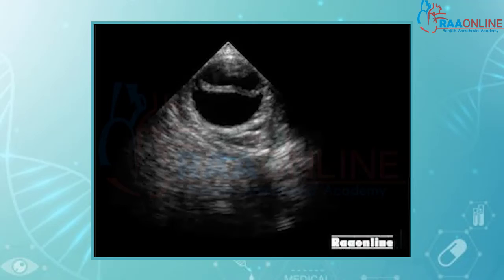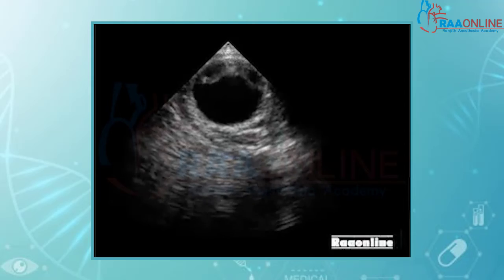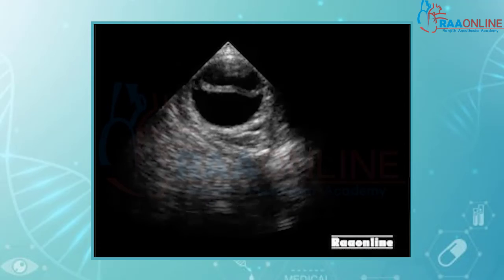Let's take a look at the video. So as you can see, there's a true lumen and a false lumen. The one below is the true lumen.